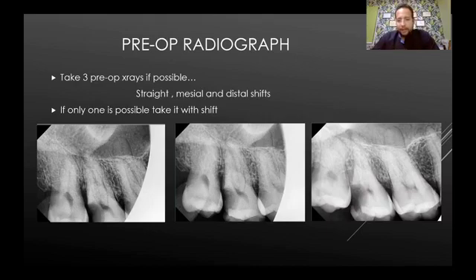As you see, it gives me information about the size of the cavity, the extent of the caries, and the form of the roots. Really good information, so I recommend taking three preoperative radiographs.